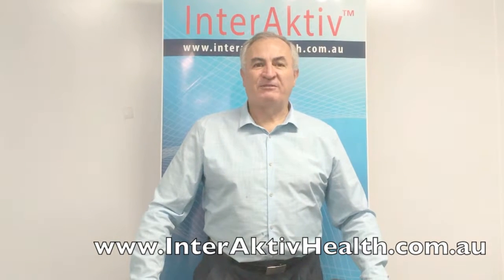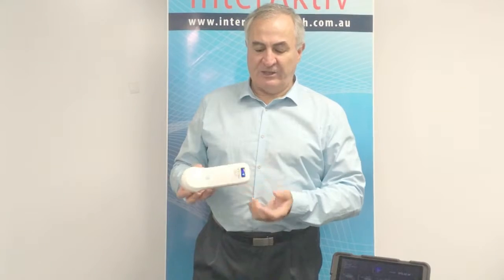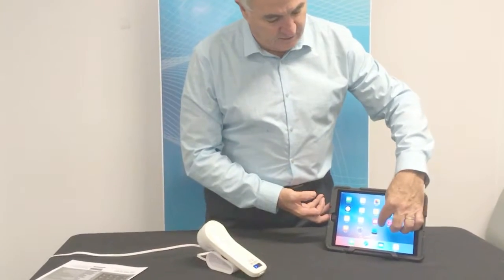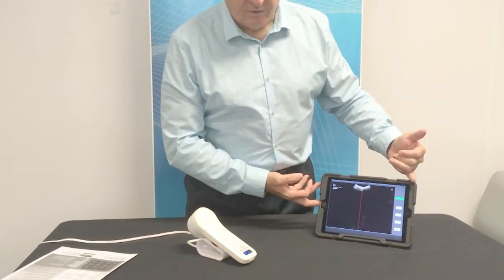Hi, I'm Greg from Interactive Health. Welcome to the world of wireless ultrasound. Today I'd like to introduce you to the wireless bladder scanner from Interactive Scan. As you can see, there's no cable, so you have the convenience of being able to carry the probe and your iPad or iPhone to use for scanning. You can select the Bladder Scan app and you're then ready to scan.